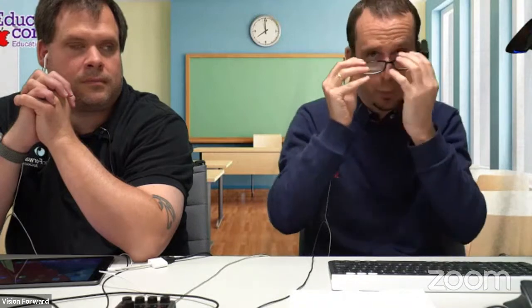And I'll hold my hand out with the fingers extended to stop it reading. So pointing and holding your hand out in a stop gesture are very natural to do. Mm-hmm. And so I would say this device is easy to operate for the most part. There are some intricacies. But it's very fast with its OCR, and it's very accurate, which is really nice.